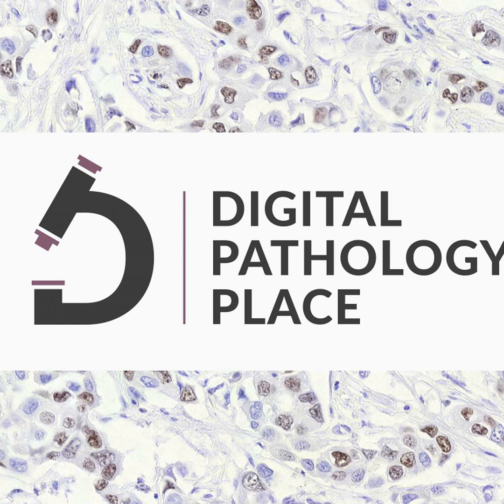And what you have to keep in mind is that this is at 20x magnification. So we're actually training ResNet 50, a relatively modern convolutional neural network architecture, end-to-end with images that are 50,000 times 100,000 pixels without actually needing a supercomputer. So you did hack it. Yes, we did hack it a bit.